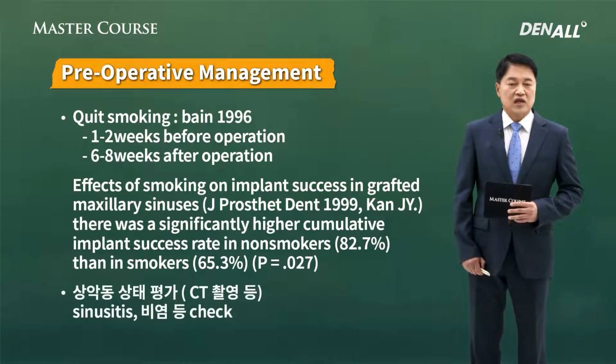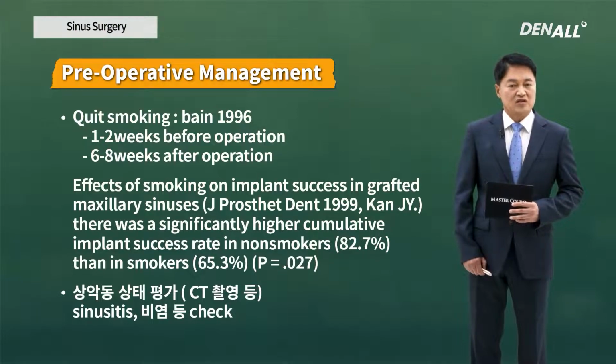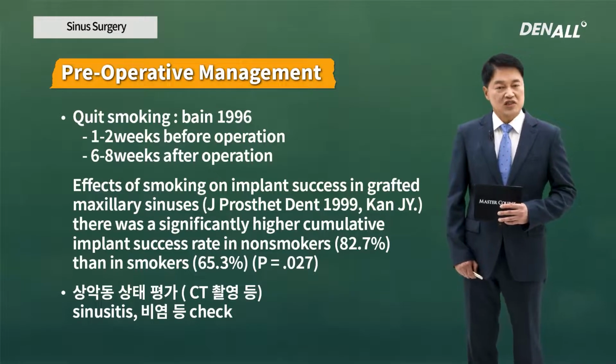Also, before sinus surgery, CT needs to be taken to evaluate the state of the sinus. You need to check whether there is sinusitis or rhinitis or other inflammation. Take CT for that.